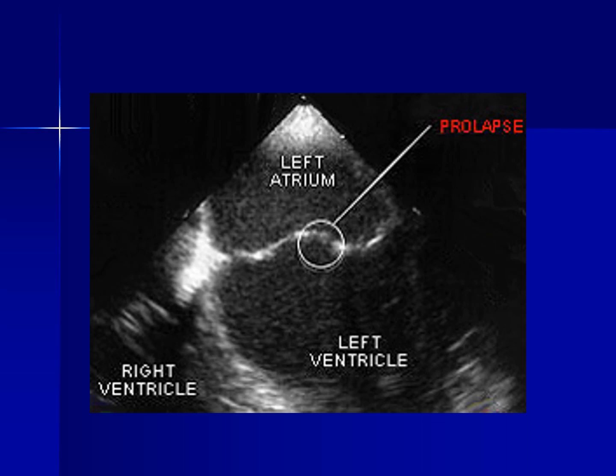That ultrasound image shows us prolapse in the mitral valve. The mitral valve is between the left atrium and left ventricle. When it is not closed fully while the heart is working, there will be regurgitation. The blood flow returns from the left ventricle to the left atrium. The door is slightly open.